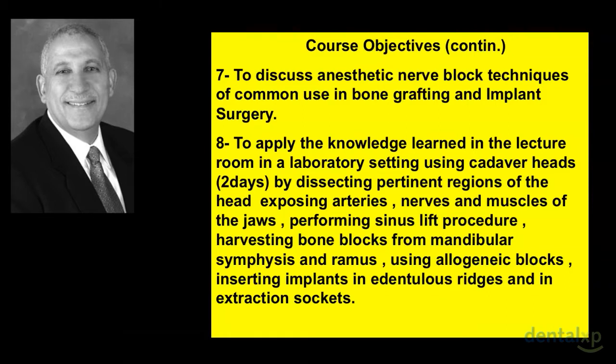That's an example. So then 8, we will apply the knowledge learned in the lecture room in a laboratory setting, and that's unique about this course because we're going to use cadaveric heads for 2 days, and we will be dissecting the pertinent region of the head. We're going to expose subcutaneously the arteries, the nerves, and the muscles of the jaws, and then perform the surgical procedures that we're going to learn, like the sinus lift procedure, how to harvest bone blocks from mandibular symphysis and ramus, how to use bone bank blocks, and how to insert implants in the edentulous ridges.